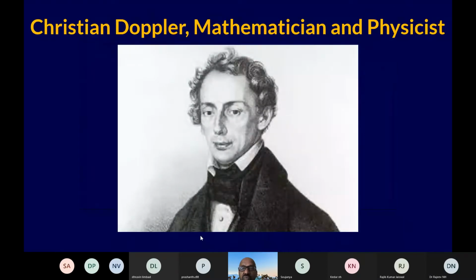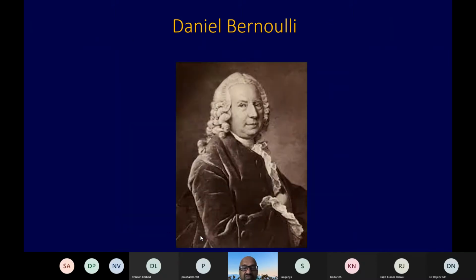When you talk about Doppler, we have to mention two names: Christian Doppler, who was an Austrian born in 1803, who was working with astronomy, and he discovered the effect of change in frequency when the object is moving, when there is a stationary transducer. Hence this effect is called the Doppler effect, which is used in Doppler echocardiography to the patient's benefit.